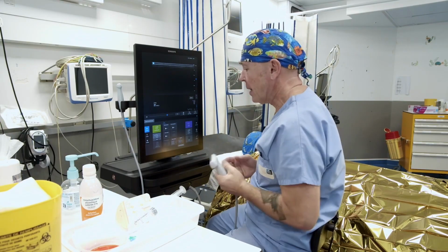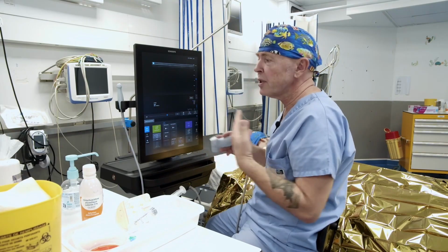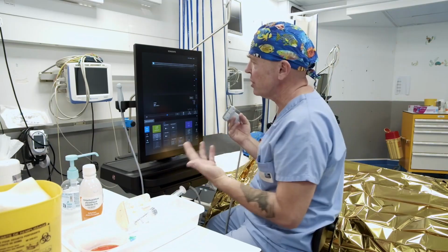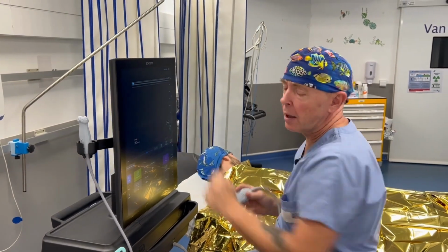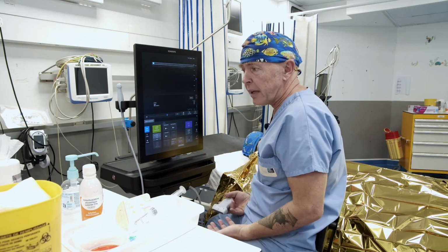It seems like a small detail, but when you're starting out, it's a bit complicated. Moreover, if the patient isn't very echogenic, reversing the images, especially in interscalene or similar cases, can be challenging. So get into the habit of always doing the same thing. Always puncture and start puncturing the same way. This will give you the same images every time. So really the fundamental step and workshop is ergonomics.